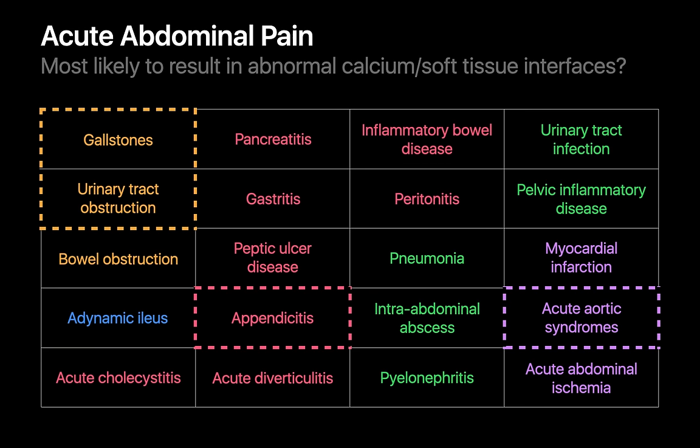While not every gallstone, urinary tract calculus, or appendicolith is calcified or symptomatic, seeing a calcification pattern typical for a gallstone, urinary tract calculus, or appendicolith may reasonably warrant further diagnostic workup for obstructing gallstones, acute cholecystitis, urinary tract obstruction, or acute appendicitis. Likewise, while not every calcified abdominal aortic aneurysm is acutely symptomatic, seeing a calcification pattern typical of an abdominal aortic aneurysm could warrant further workup for an acute aortic syndrome in a patient with acute abdominal pain.